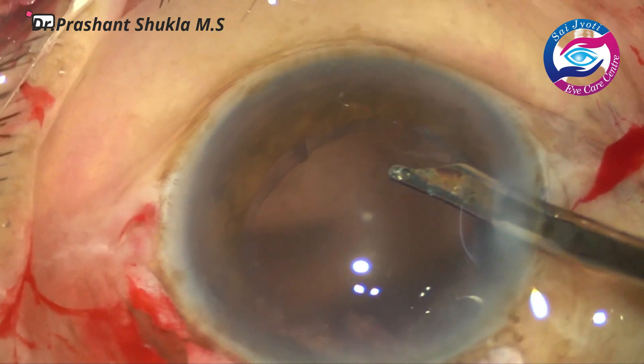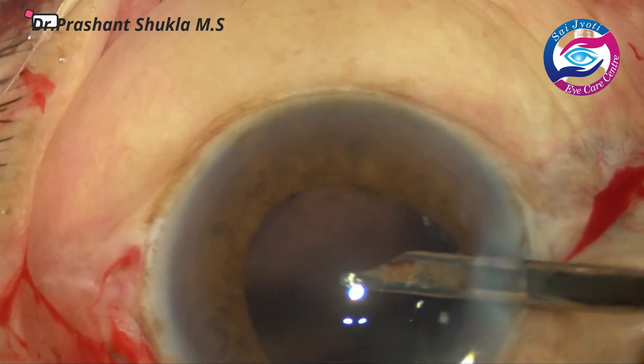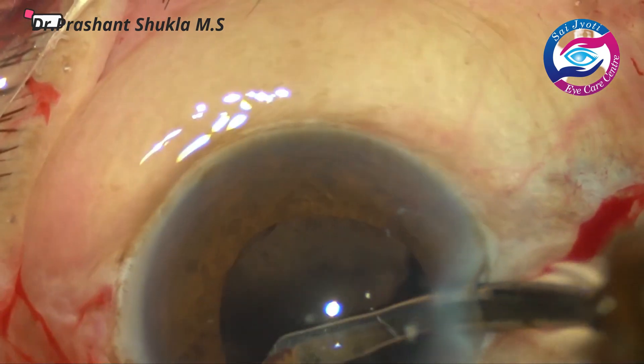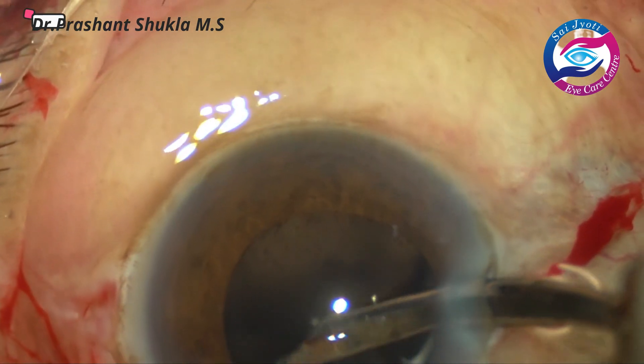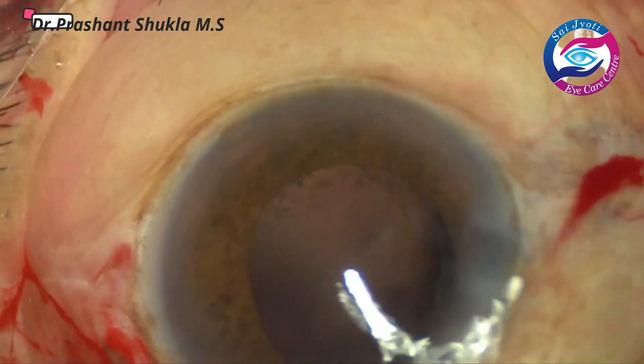The rest of the cortex is removed through the Simcoe cannula through the side port. When we use the Simcoe cannula from the main port the chamber usually collapses and carries a greater risk of a posterior capsule rupture. So it is always a good idea to use the Simcoe from the side port.